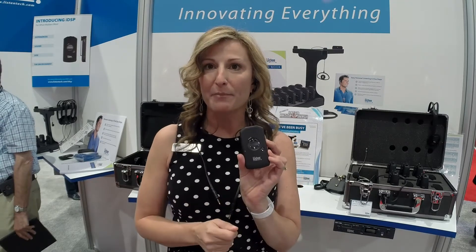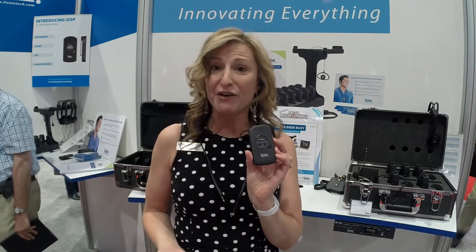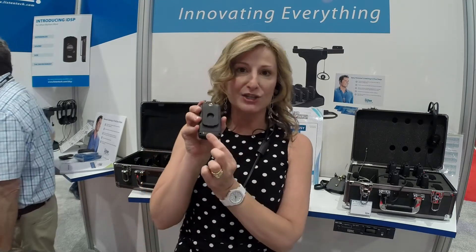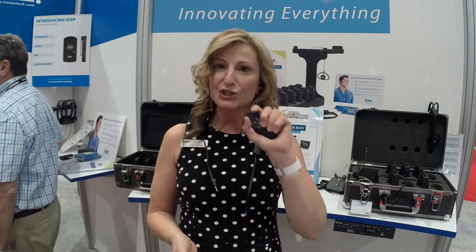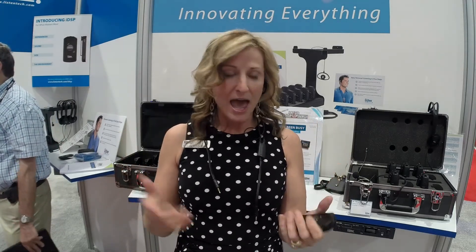Another great advantage is it uses a lithium-ion battery — the same battery we use in cell phones. All I do is drop it into a charger, and it starts to charge and turns itself off. Then as soon as I pick it up to use it, it turns itself on. I don't really have to do anything. It's just super light, super easy to wear, and it delivers incredible sound quality directly to a user's ear, whether they need a little help with assisted listening or want to hear in their other language.